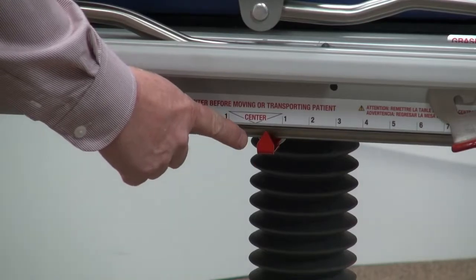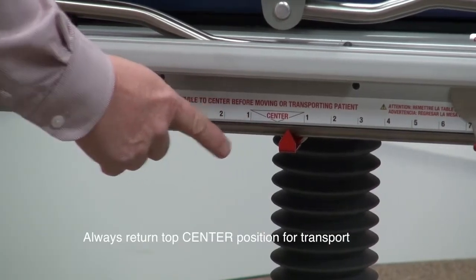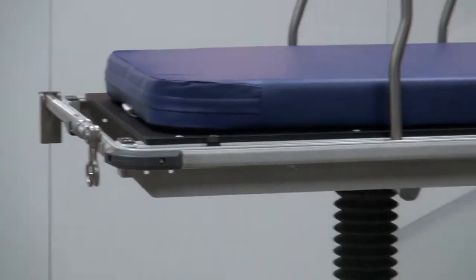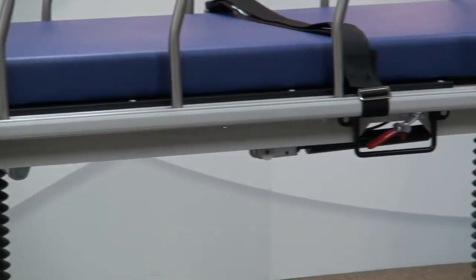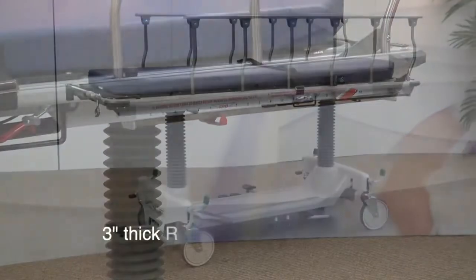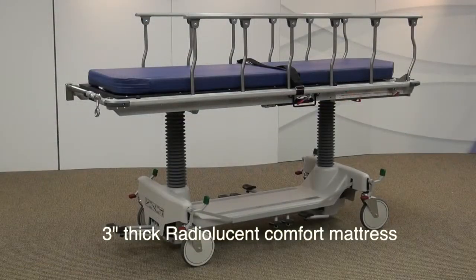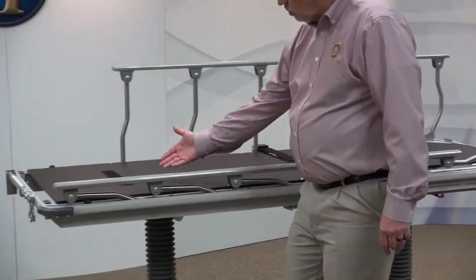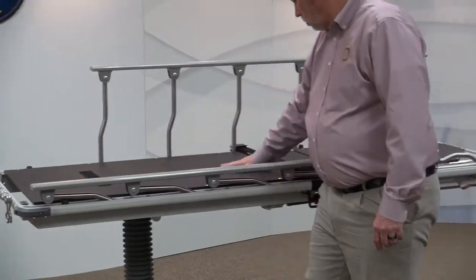The top should always be returned to the center position for transport. Heavy-duty, non-marring bumpers are mounted on all four corners to protect the stretcher and facility walls during transport. The 3-inch thick radiolucent comfort mattress adds to the patient's comfort. The stretcher is also manufactured with a full-length radiolucent top, which provides minimal X-ray attenuation.